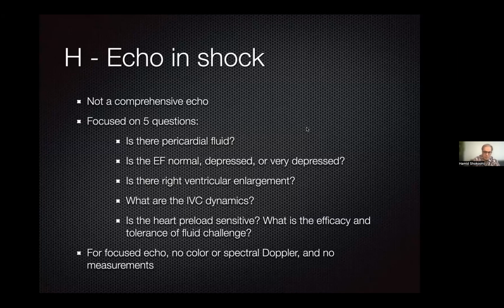Let's focus. We said that cardiac is the most important part of this RUSH protocol. For the sake of the shock protocol and shock evaluation, what we want to know about echo in shock. Number one, we said you do not need to have a comprehensive echo.